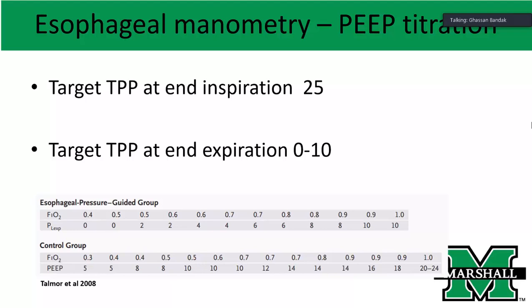Now, if you have a lot of extra pressure on the lung, the pleural pressure component is high because of morbid obesity, pleural effusions, compartment syndrome, then at end expiration, the lung might collapse and go into atelectasis, right? What you need to do is to use much higher PEEPs to counteract these forces. And sometimes the plateau will end up being more than 30.